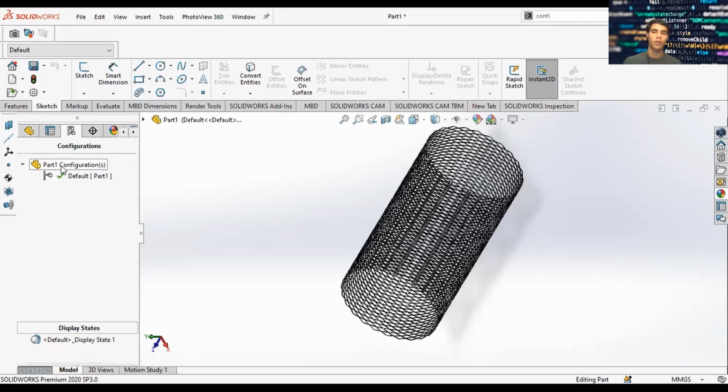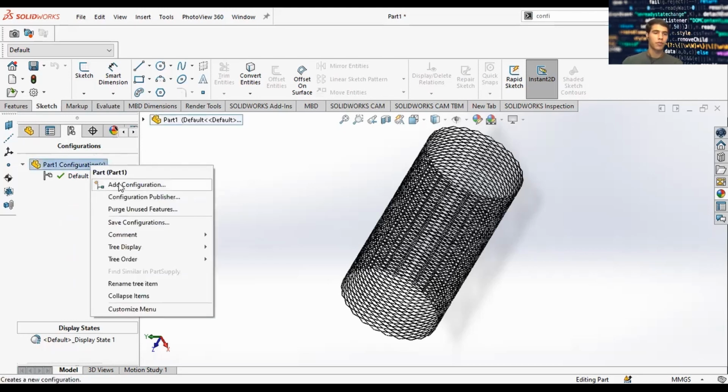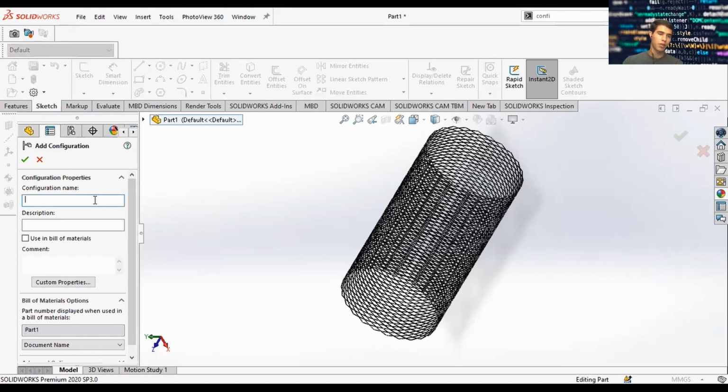So here's our part, and it's called part 1 right now. We can make configurations of this part since we know not everyone has requirements of a stent or an embolization device that is specifically 5 millimeters in diameter and 10 millimeters long. Some people might have cases where they need a longer stent or a smaller diameter. So we're going to go to configurations and we're going to add a configuration. This configuration name was 5 millimeters, 10 length. Description: 5 millimeters diameter, 10 millimeter length. Right? And that's good.